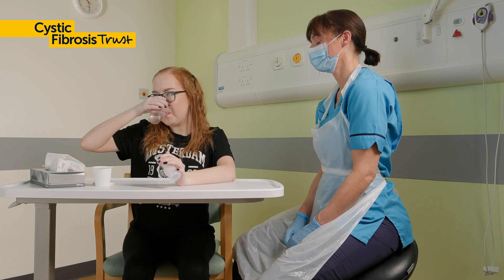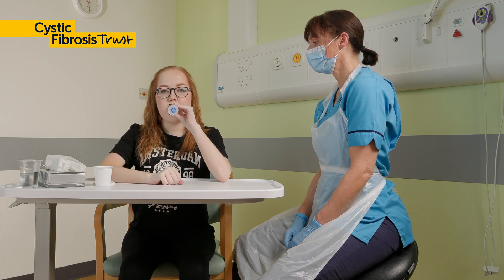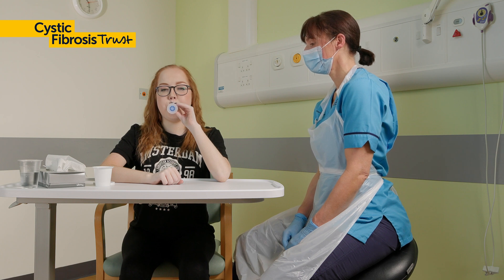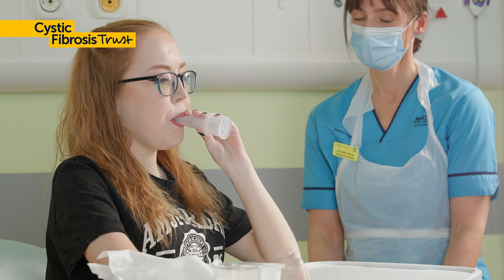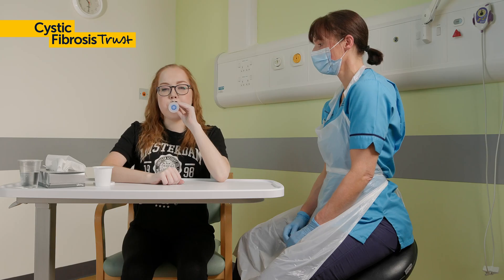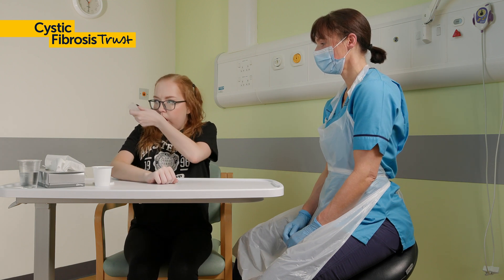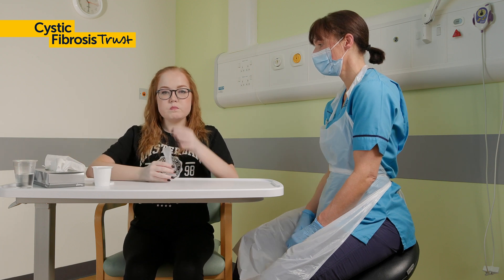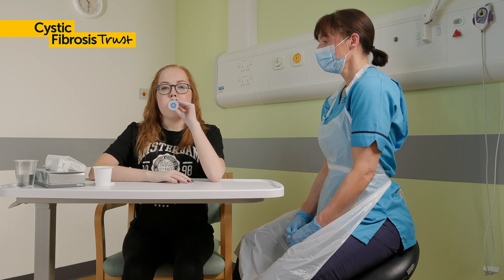You may find that there isn't anything to cough up after the first cycle. That's okay. Keep going on to the next set, and you should find the mucus starts to move. Have a sip of water to prevent you from coughing. You may still find you cough during a cycle. That's okay — finish coughing, have a sip of water, and return to normal breathing for a few rounds until you feel ready to carry on with PEP.